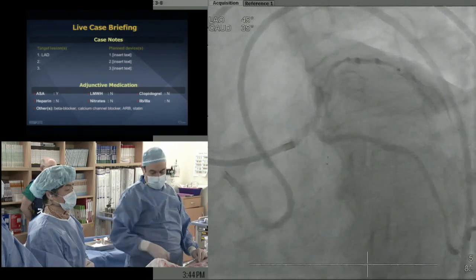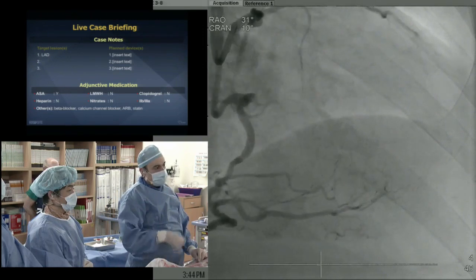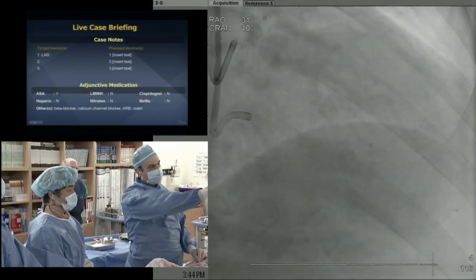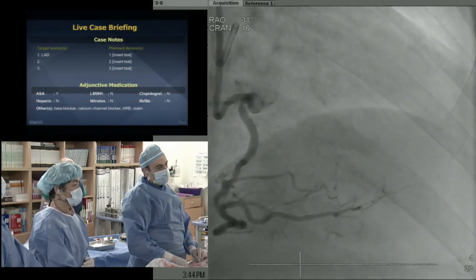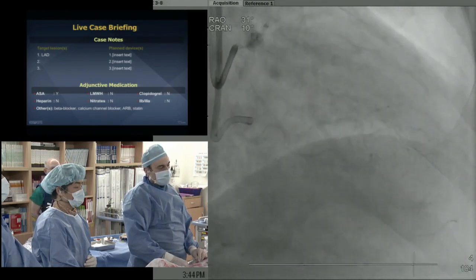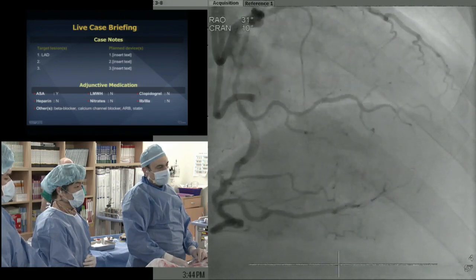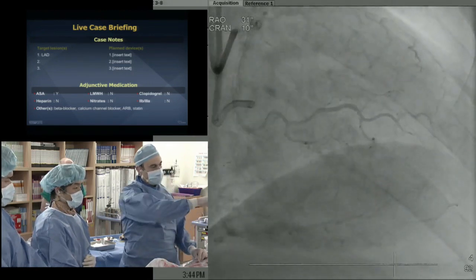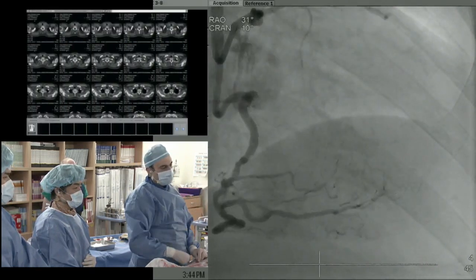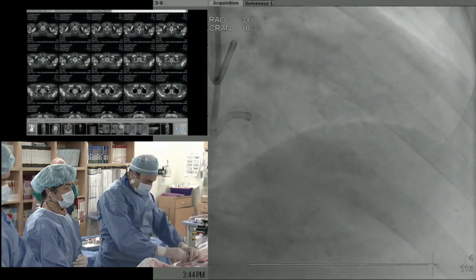Given the collaterals, and that the distal cap is at the bifurcation with a diagonal of not insignificant size, our thought was to explore briefly whether we can get into the most promising collateral, at the distal part of that small parallel PDA, and take it from there.